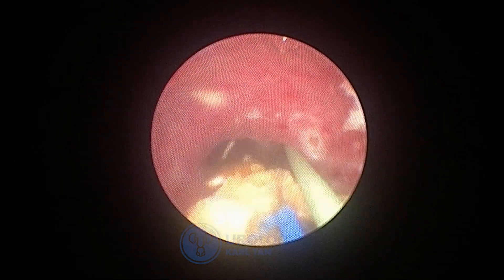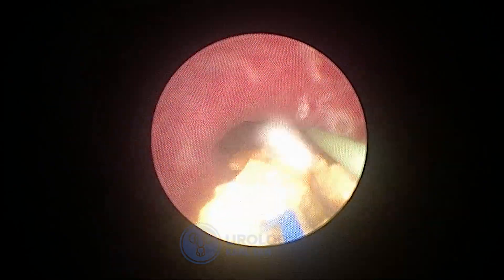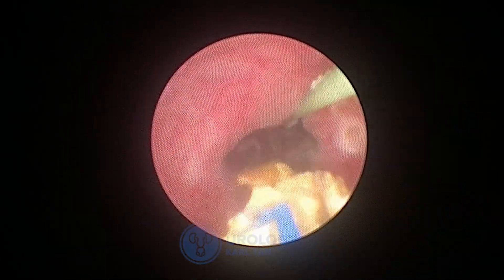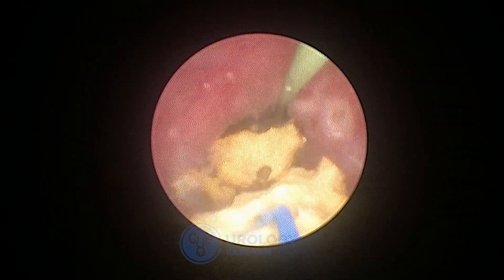After a while, you can notice we are almost able to clear out most of the stone. There's a little bit of ureteral injury, but it's very minimal — not the kind that causes nightmares. We're almost done clearing the stone. You can see there's still no retropulsion; you can clear the stone quickly, and fragment and dust it at the same time.